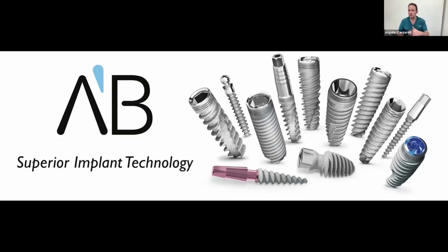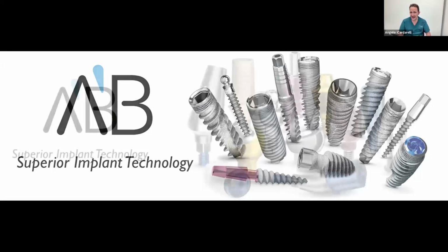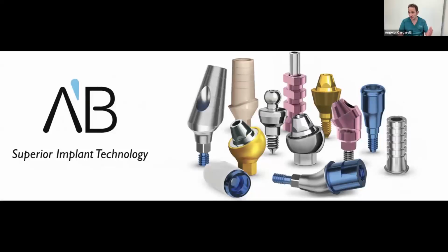Instead, if we want to use it in the mandible, where the bone is harder than the upper jaw, we will use less aggressive threads in order to reduce the compression between the implant and the bone, avoiding any kind of bone resorption. And also the prosthetic part is different if we are talking about internal connection or conical connection.